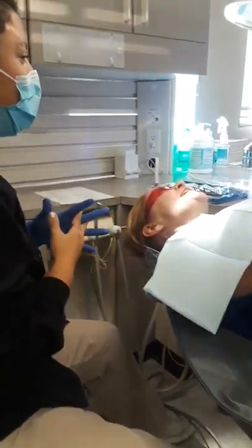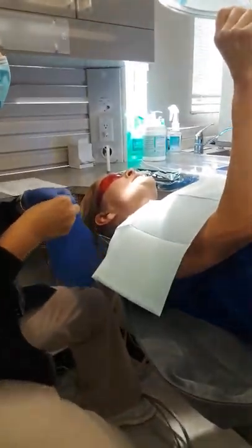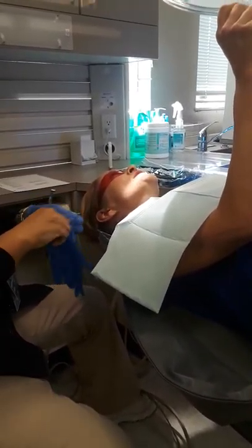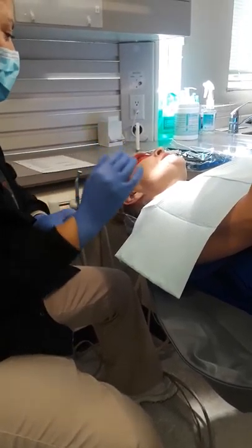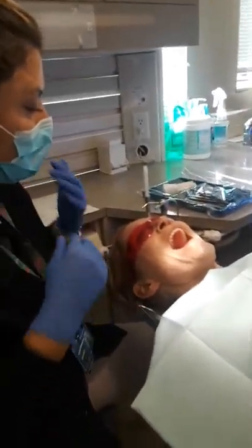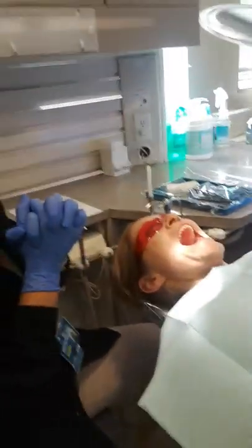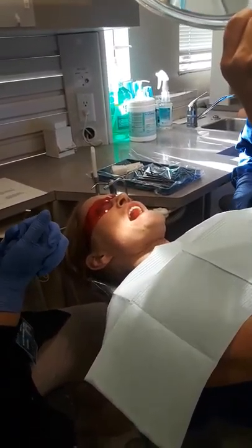Rinse, dry, and retract is the most important thing as a dental assistant. When you're on that side, you have to make sure that you're out of the doctor's way, but you have to capture everything that's in the mouth. We'll start on the upper right and then go around the entire mouth so you know where to position your suction, your mirror, and if you're going to retract.